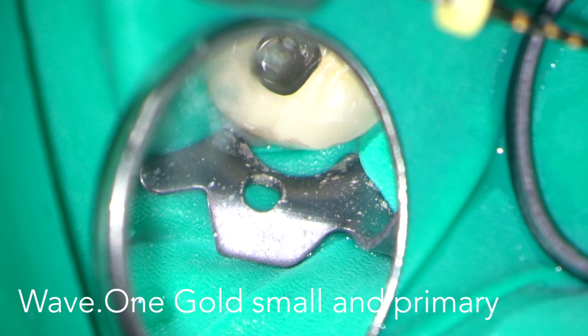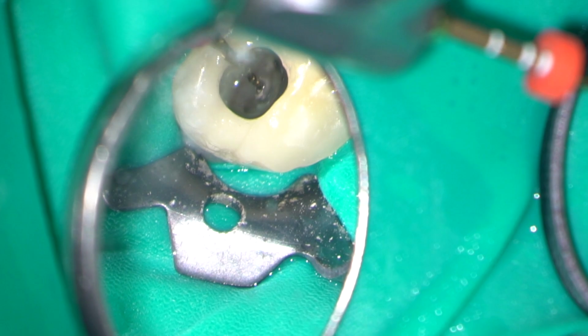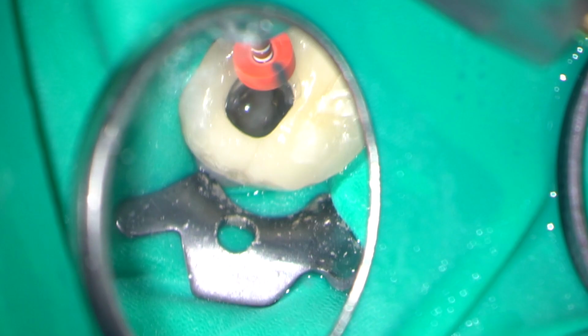I'd managed to watch wind the size 10 hand file to the working length and create a small glide path. However, there was GP still to remove, and this is why I used the small instrument first and finished on a primary.